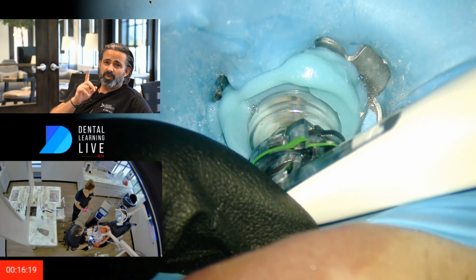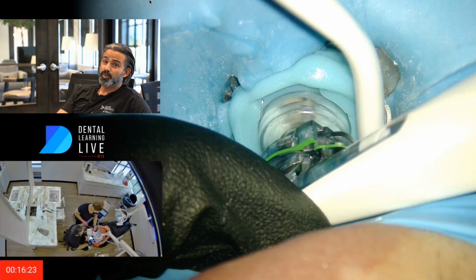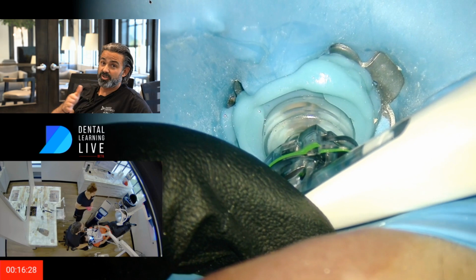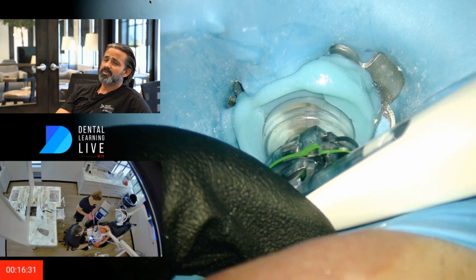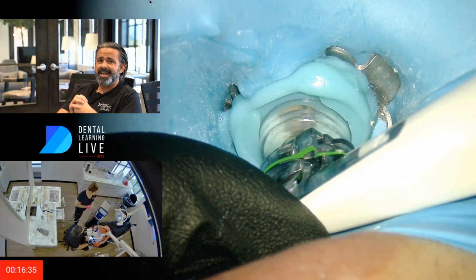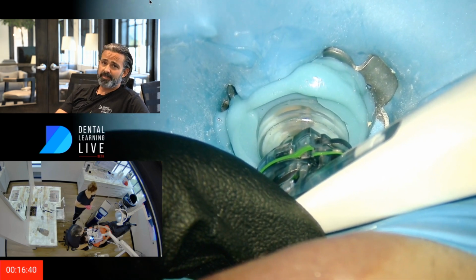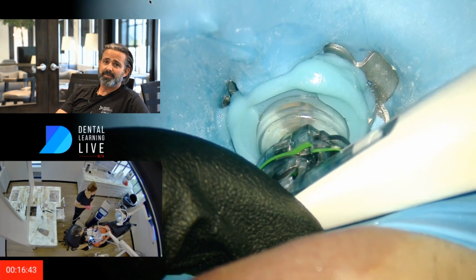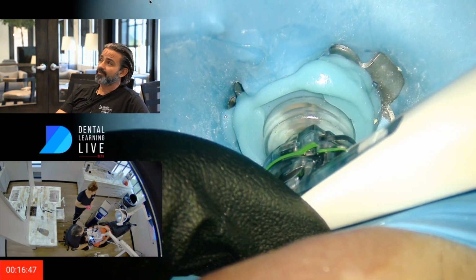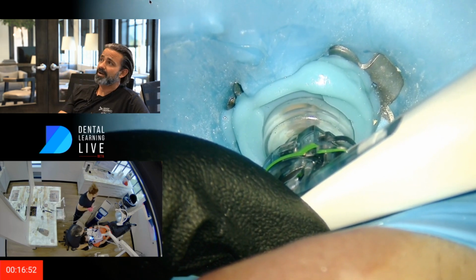Now, a couple points like I talked about. I made a pathway with that instrumentation. It was really quick. If you go back and watch the video, that red clock is true to the time. It was only a few minutes. And like I said, the idea of establishing patency didn't happen on this case. I wasn't going to patency file, certainly because I'm relying upon the GentleWave. I love pointing that out for you guys to just think about. And as you use the GentleWave, consider that talking point.